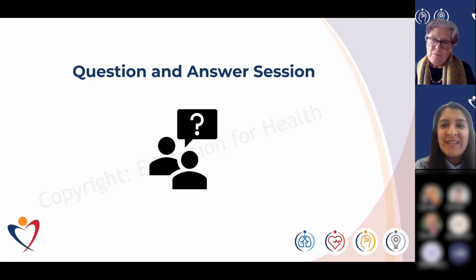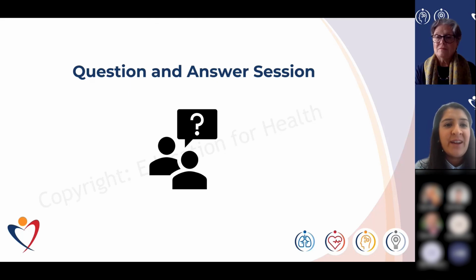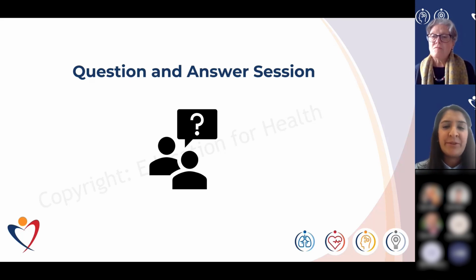So I think it's fair to say, like Julie said, that completing the ARTP certification is good practice in order to perform good quality assured spirometry, and that includes every component of spirometry. If you're only involved in the reporting of the results, i.e. interpreting, then you would need to complete the interpretation certificate. Or if you're involved in every part of spirometry, then you will need to complete a full ARTP certification. So it really depends upon the role that you're undertaking in spirometry.